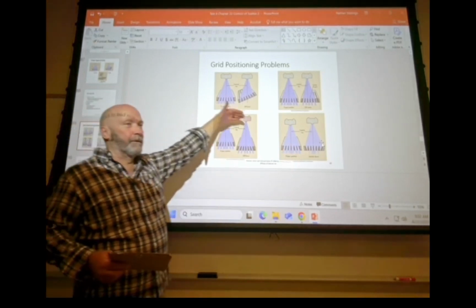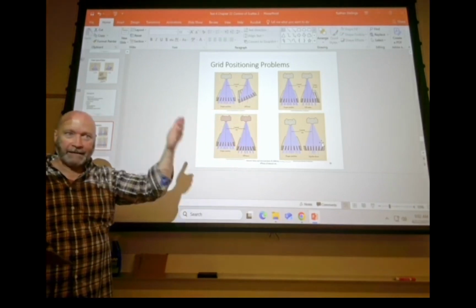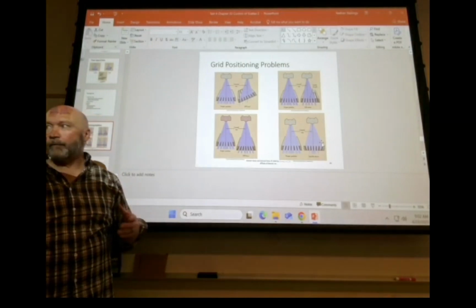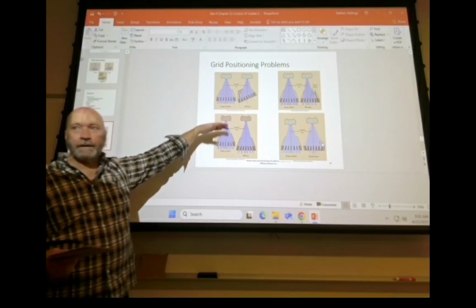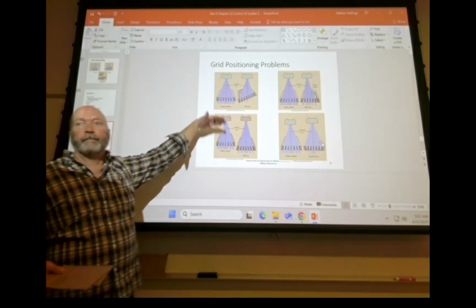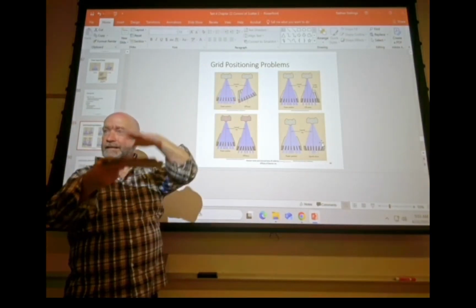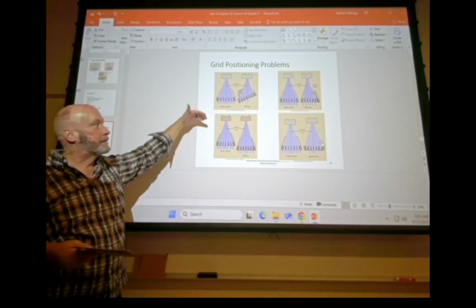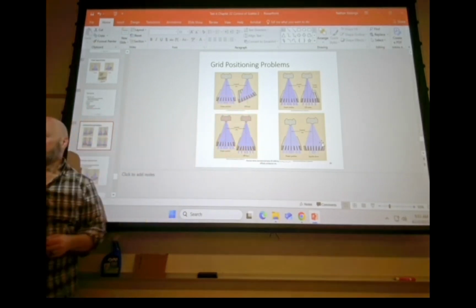So tilted grid, just so you know, they refer to it as off level. You're going to have a tendency to think of tilted as being one thing and off level being something totally different. To me, exceeding the focus sounds like a better description of off level, but in this case, I guess they're talking about it level to the perpendicularity of the central ray. So tilted equals off level, equals grid cutoff.